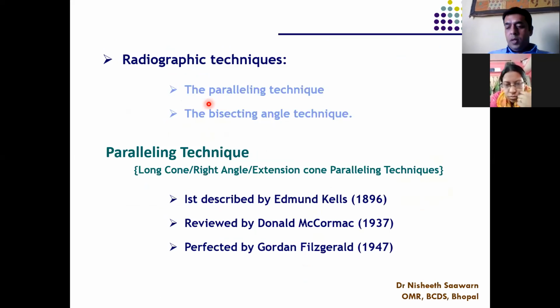We'll come to the radiographic technique. This is called the paralleling technique radiograph. Now write down these names. The paralleling technique is also called the long cone technique, right angle technique, or extension cone paralleling technique. It was first described by Edmund C. Kells in 1896.